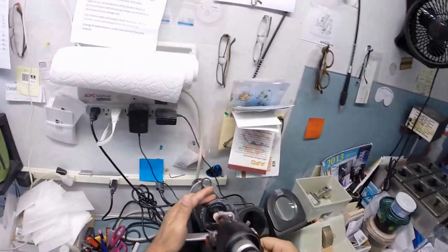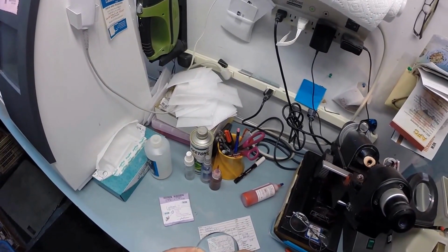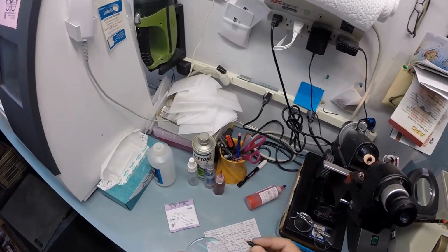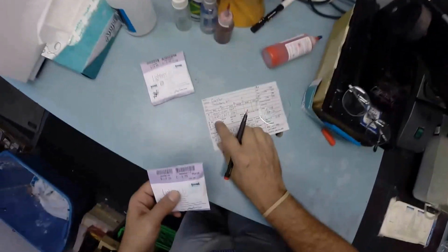That looks good, and I'm going to put 3 dots on your lenses, which are probably too light for you to see, so I'm going to darken those. 1, 2, and 3. And I'm going to put an R on there for right. Let's do the same thing for the not right lens.